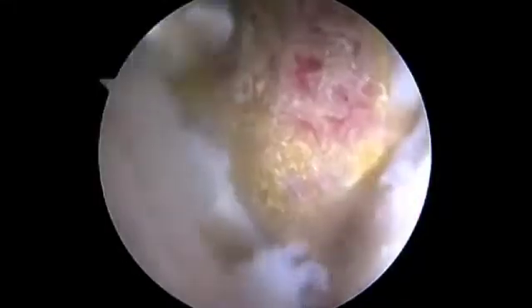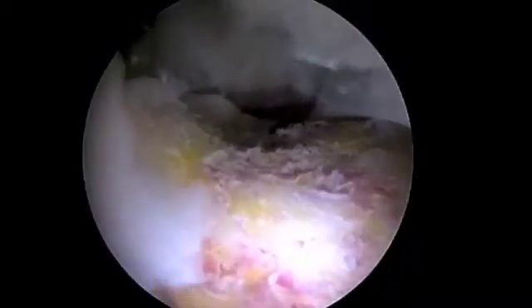As the hip is brought back into full extension, the superior aspect of the CAM lesion in the region of the pistol grip deformity can be assessed and rounded out. The bone is typically softer in the superior region of the CAM, and using the burr on reverse can be helpful in preventing over-resection or gouging. Once the medial rounding is complete, bringing the hip into deep flexion with your dynamic exam can be helpful to confirm an adequate CAM resection. The hip should also be checked in abduction to assure clearance superiorly.